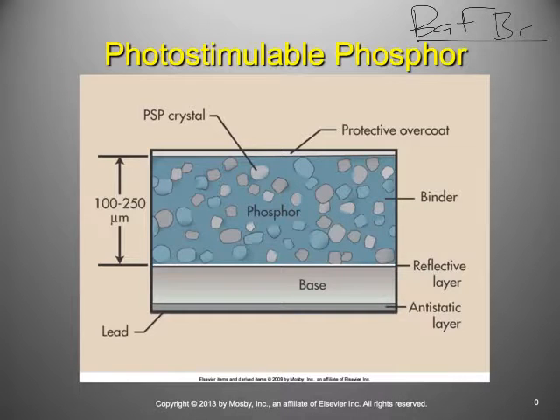The significant thing about this is that this is a phosphor that's going to be inside of these computed radiography cassettes, and it's doped with europium, so it always has Eu next to it. The europium is really an important part of it. It works to capture the latent image. What happens is, when the barium fluorohalide is hit by the X-ray, it fluoresces slightly.